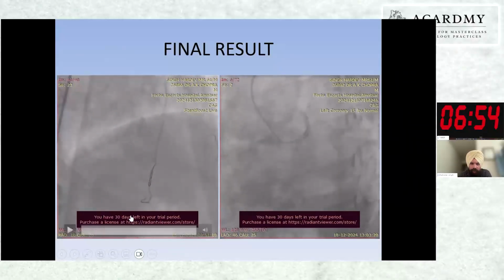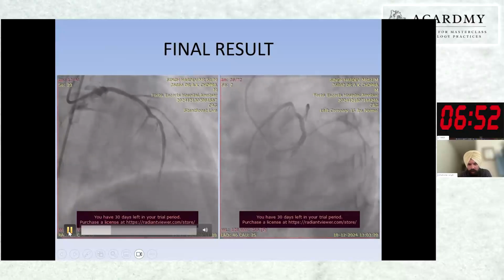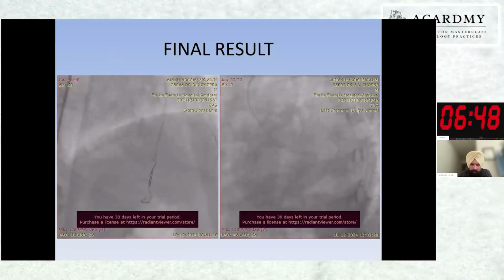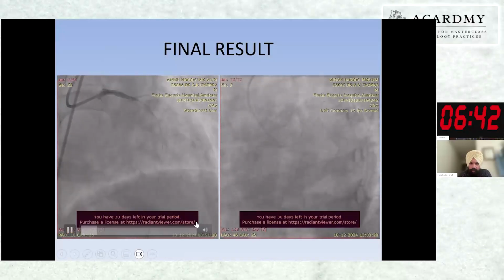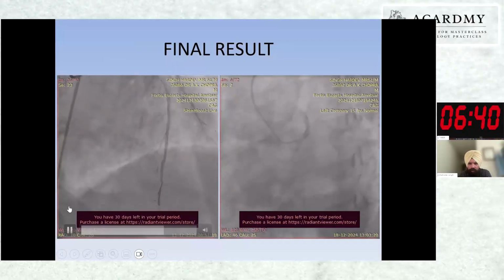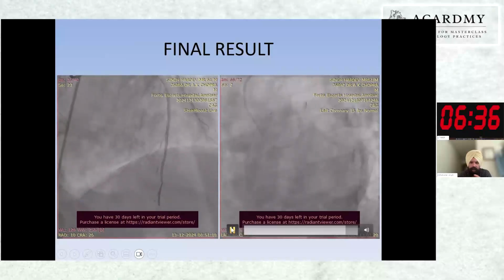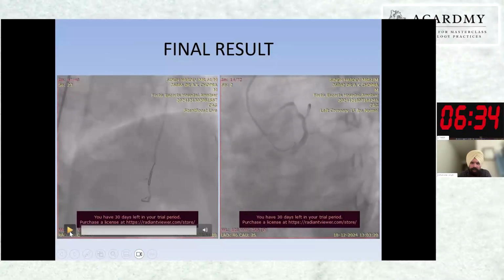The patient was on norepi and epi at 15 ml, both norepi and epi, and on IABP. And we also started a tirofiban infusion. Then the patient was off the IABP after 3 days with inotropes reduced to around 4 to 5 ml of norepi and epi. And then we decided to recheck the angio after 3 days.